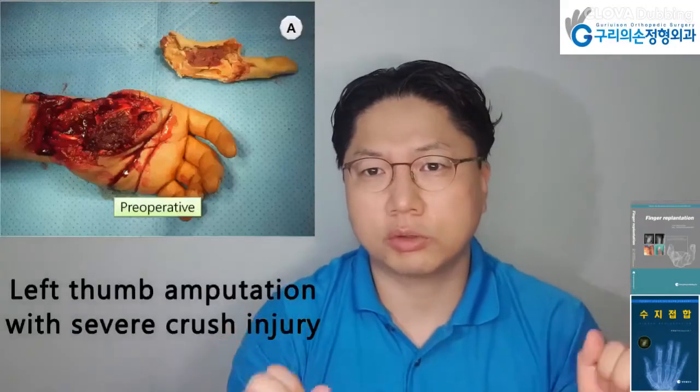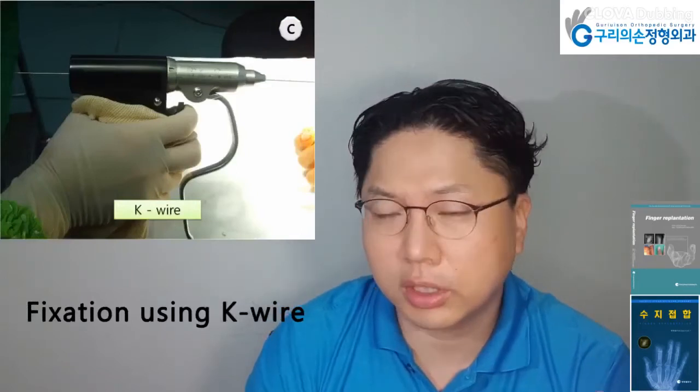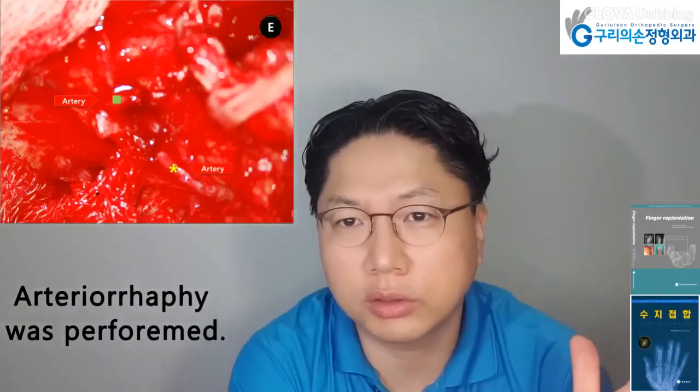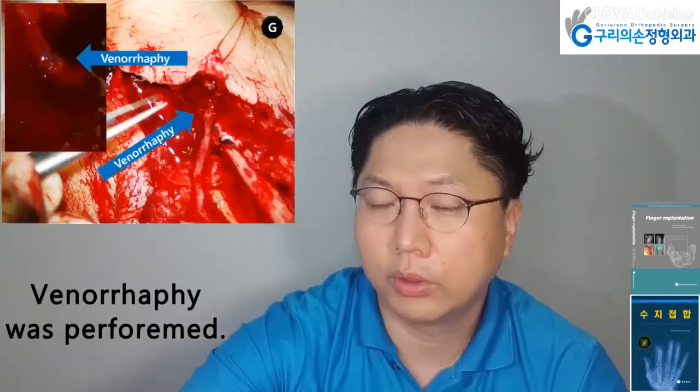Left thumb amputation with severe crush injury. Fixation using K-wire was performed. Flexor tendon repair was performed. Arterial repair was performed. Neural repair was performed. Venous repair was performed.